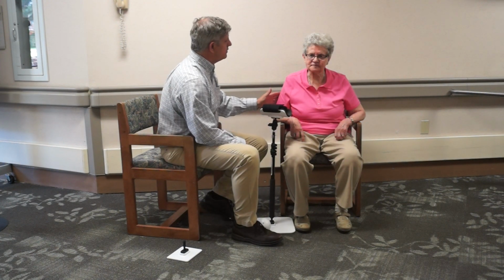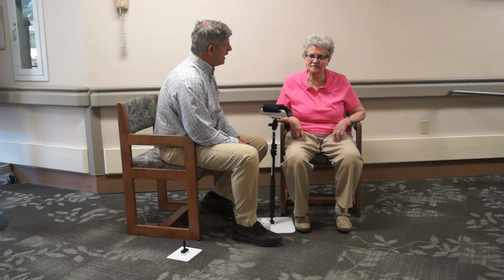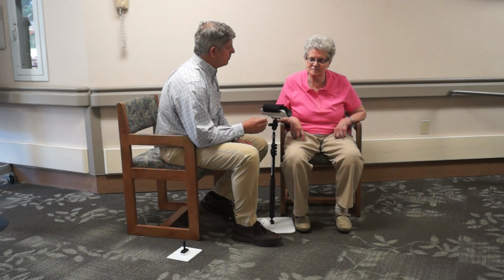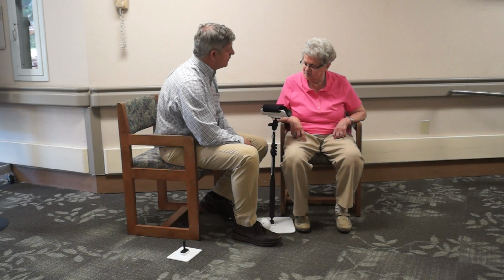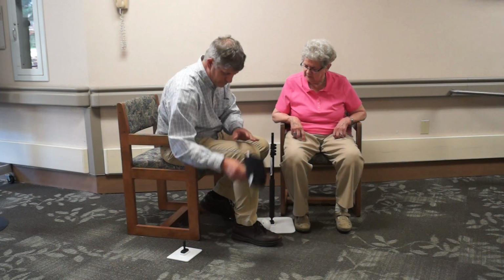Okay, Audrey, so we're going to resume where we left off, and you demonstrated good hand control, good strength with your ability to grasp. So now we're going to use an object that will allow you to utilize that grasp, and then we'll build up in your ability to both reach and sustain that grasp, like you're holding something to put it in a cupboard. So I'm going to change out this hand support.